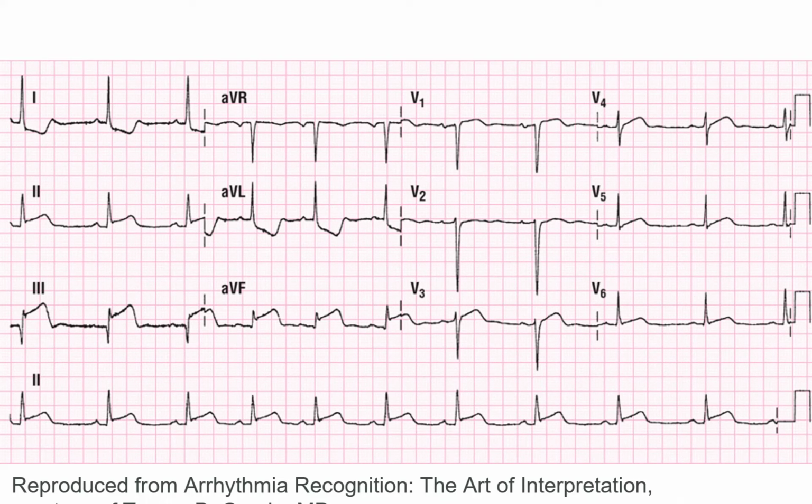Elevation. We're looking at an inferior, contiguous. Yeah, you missed part. You're all right. Too contiguous.